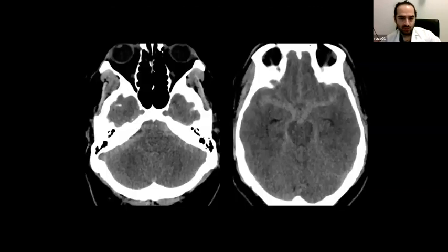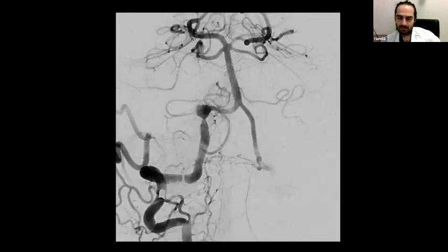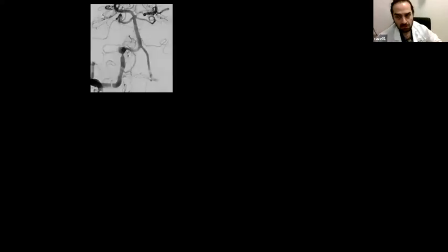Other example, patient with subarachnoid hemorrhage, mostly in the posterior fossa but also extending superiorly, ruptured dissecting right vertebral artery aneurysm, and with a decent size contralateral vertebral artery. So what to do here? Sacrifice is absolutely an option, because of the contralateral decent size vert.